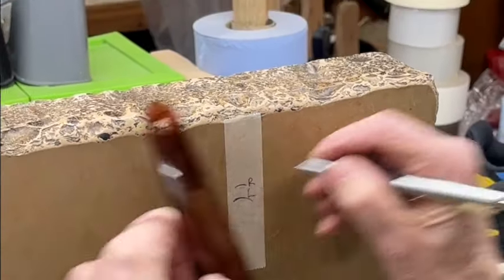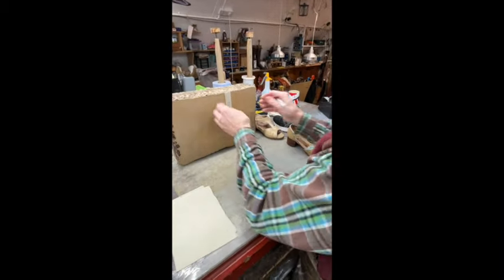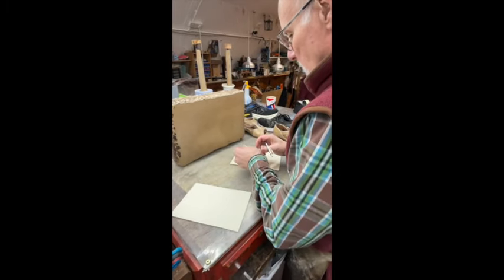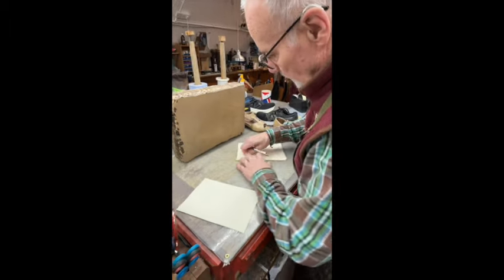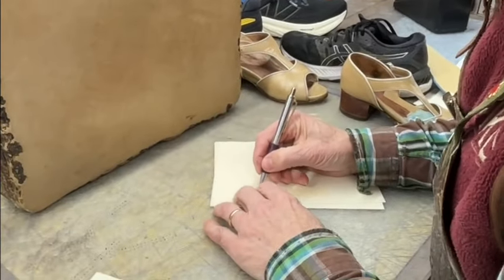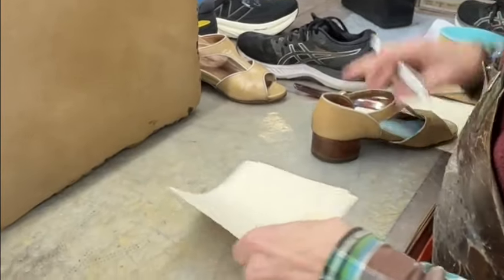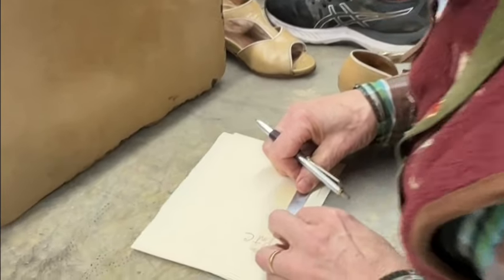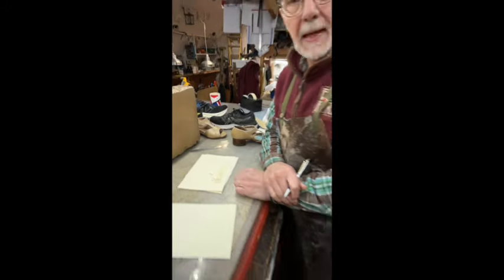This patient has got a lot more going on than just a leg length difference, but the actual difference is still measurable. Put it on the client's information form — Patient C — and the difference is nine millimeters. Thank you.